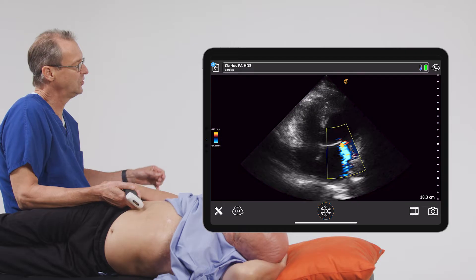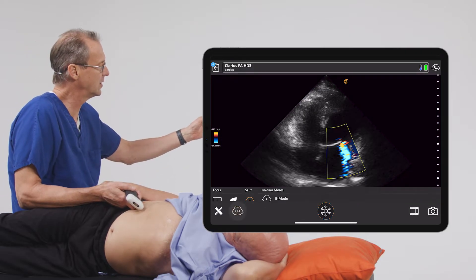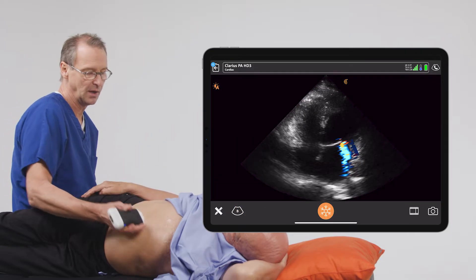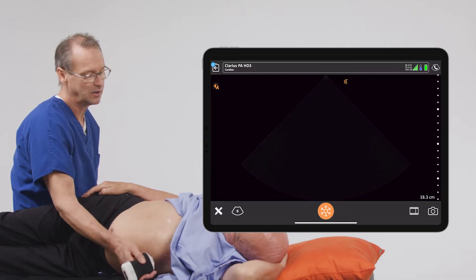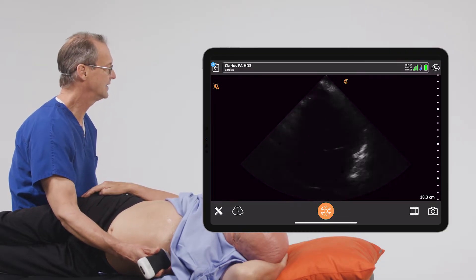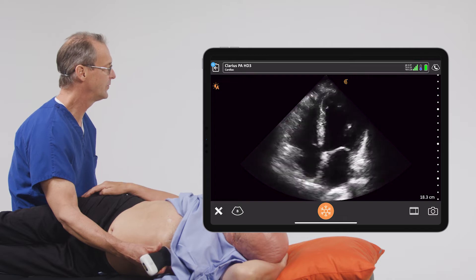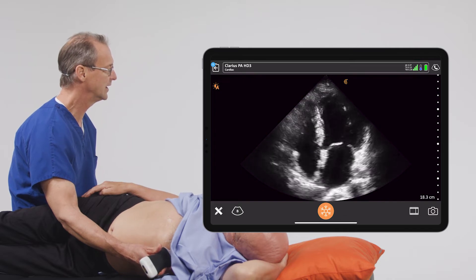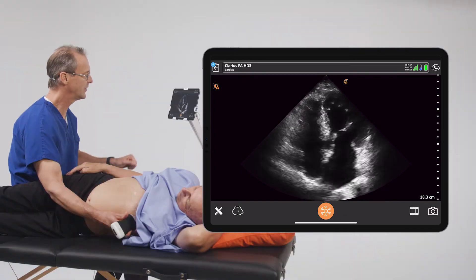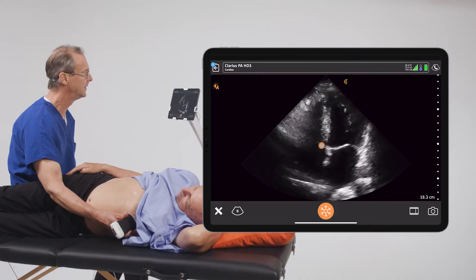To do this exam, we'll go ahead and start with B-mode. To look for this particular problem, we would like to get a really nice apical four chamber view. We have a nice one right here, and of course for mitral regurgitation, we'll focus on the mitral valve. We have a really nice view of that right here.